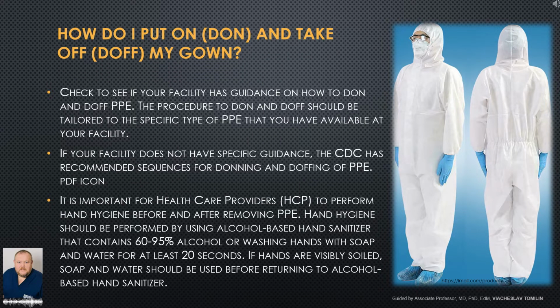How do I put on, don, and take off, doff, my gown? Check to see if your facility has guidance on how to don and doff personal protective equipment. The procedure to don and doff should be tailored to the specific type of personal protective equipment that you have available at your facility. If your facility does not have specific guidance, the Centers for Disease Control has recommended sequences for donning and doffing of personal protective equipment.